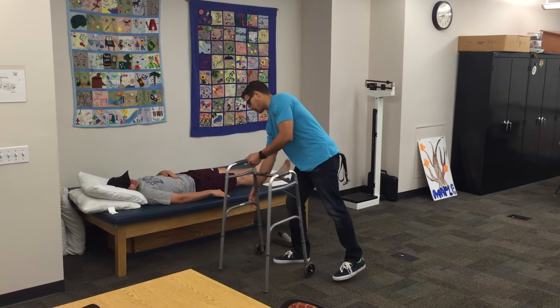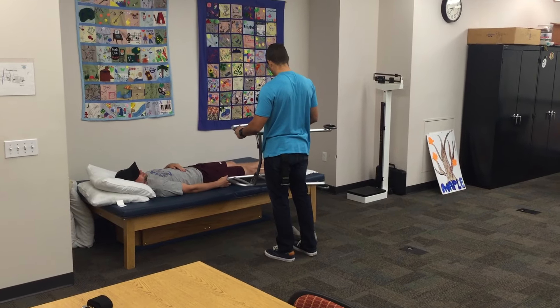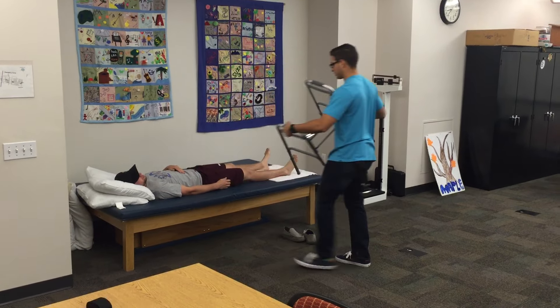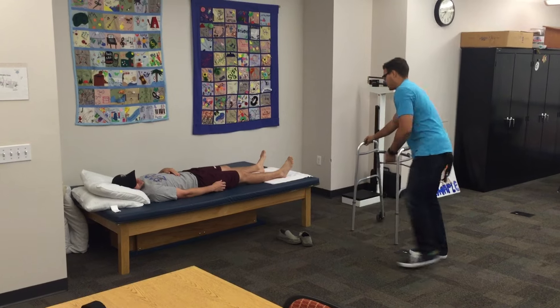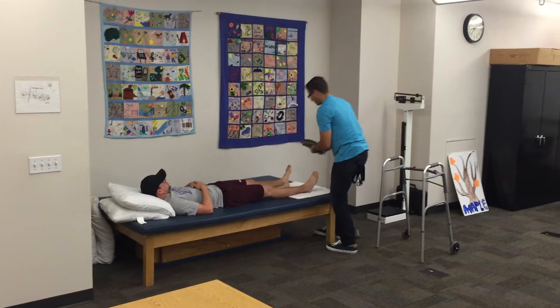Let's see if this walker is going to fit you here. Perfect. All right, let's get these shoes on here for you.